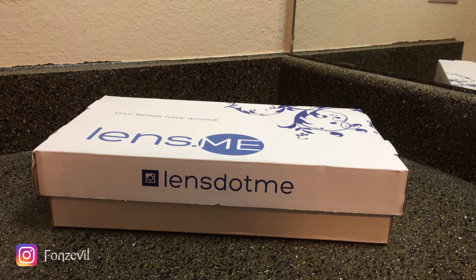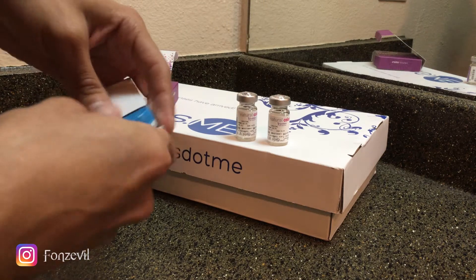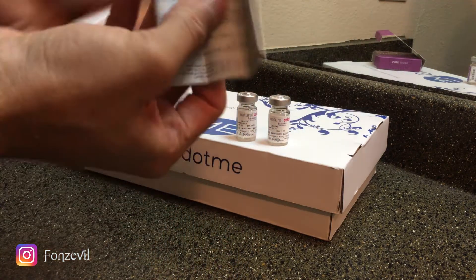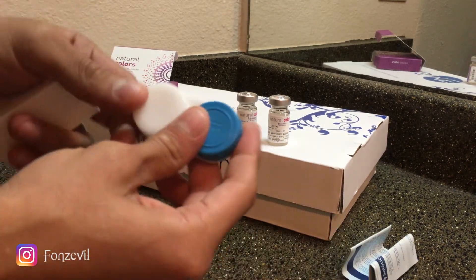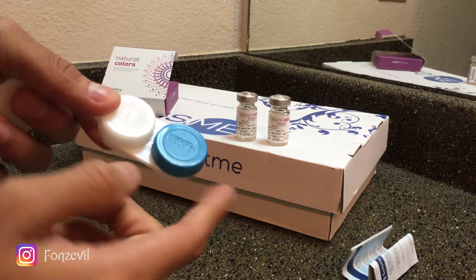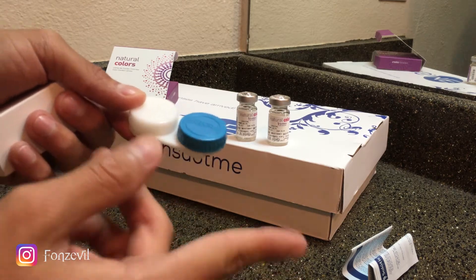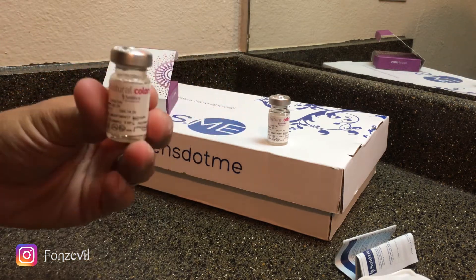So once you guys open up your box, you guys will get these manuals on how to put your contact lenses and how to take proper care of them — you guys want to read it, if not just discard it. It also comes with this little container to put your contact lenses. They usually come in different colors, so that's a good way to keep track of which contact lenses you have if you guys have multiple. The contact lenses are going to come in this little flask right here.